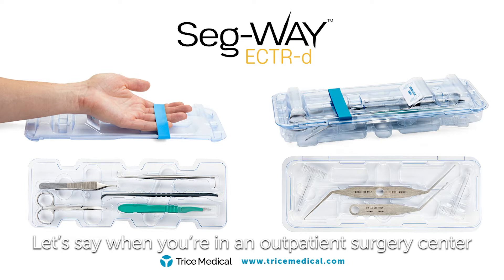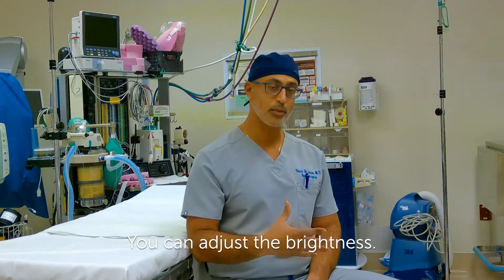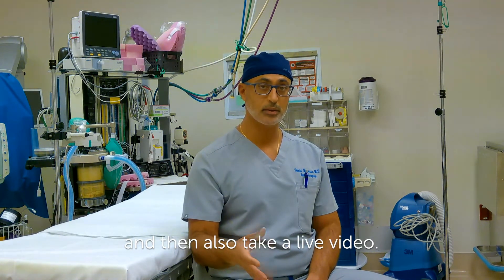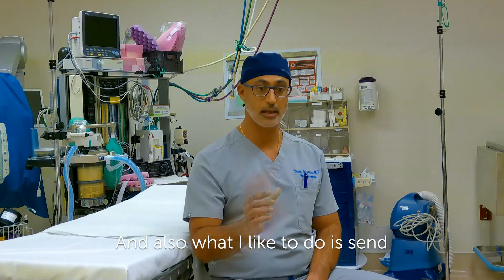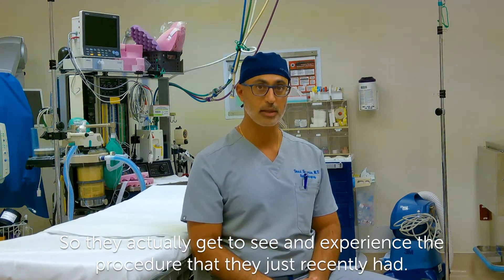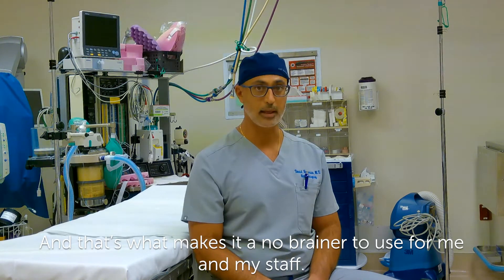Let's say when you're in an outpatient surgery center and you have multiple surgeons operating on the same day. On the camera, you don't have to worry about focusing — it's auto-focus. You can adjust the brightness, and one thing that I like is through one small button, you can take pictures and also take a live video. You can put that on a small zip drive and email the pictures or video of the procedure to your patient, so they actually get to see and experience the procedure they just had. It's very user-friendly, the whole process, and that's what makes it a no-brainer to use for me and my staff.